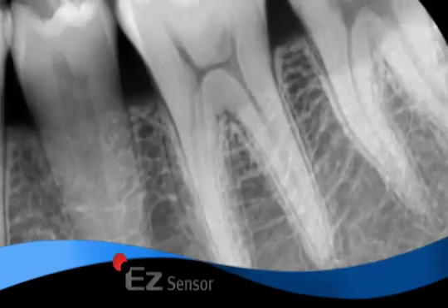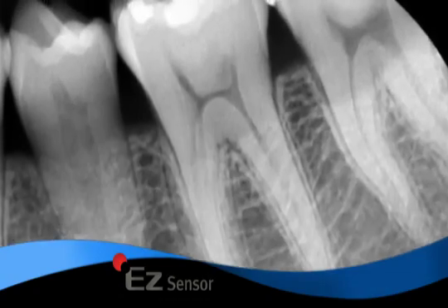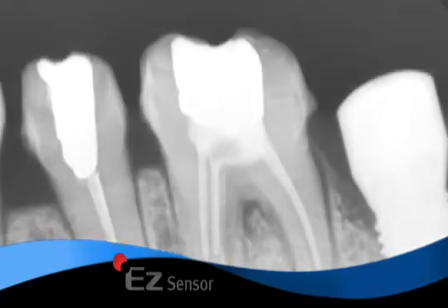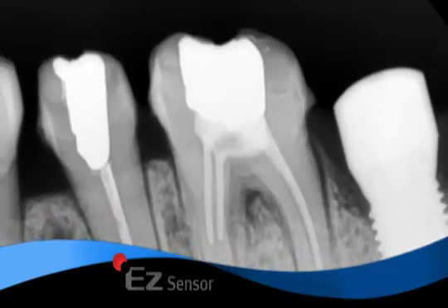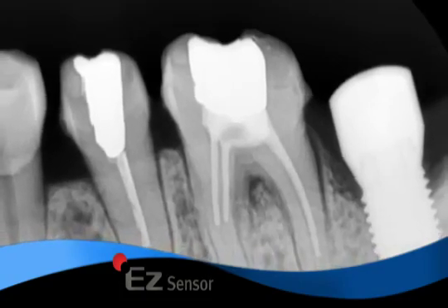With a low radiation dose, it allows for a reduced exposure time, making it safer for patients as well as your staff. The supreme quality of its diagnostic images in maximum grayscale levels is essential in detecting dental caries and endodontic treatments.